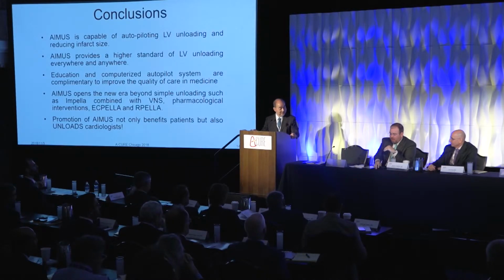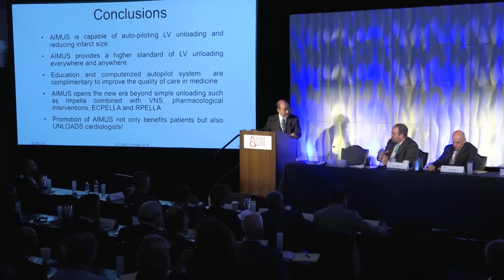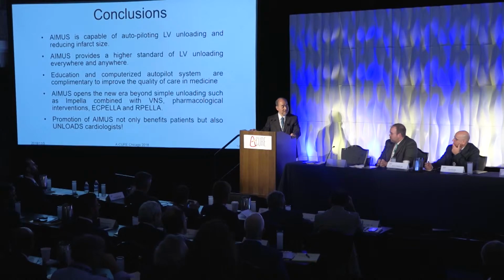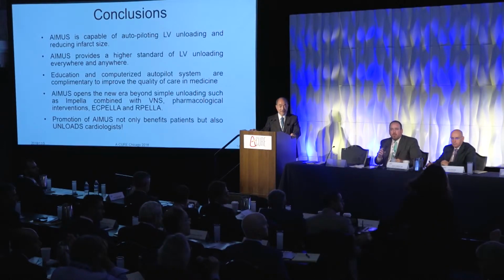Kenji, thank you. I particularly like your last statement there. The model that you've shown, although you've shown that it responds to changes in volume, at least initially, the left atrial pressure was pretty low, about 12 millimeters of mercury. Have you seen it function in a similar manner if your left atrial pressure is 25 when you put the device in? Well, if we look at each data, I think we must have such cases, but I have only pooled data at this moment, so I can't talk about individual cases. But judging from the mechanism we are using, it should work to a certain extent. Very good.